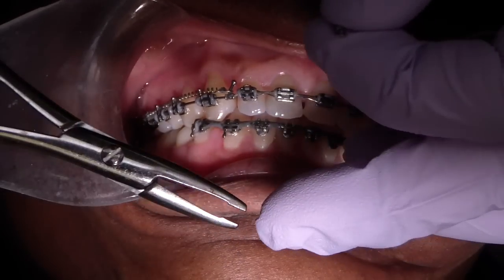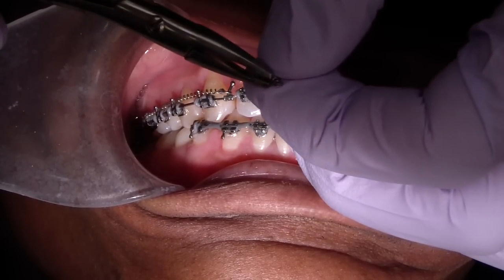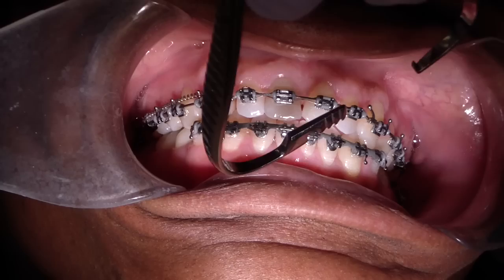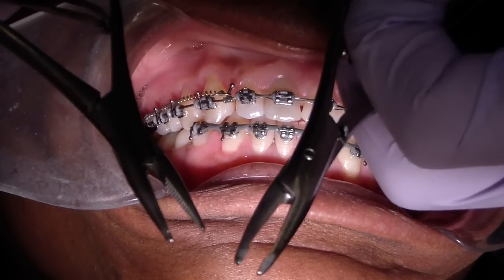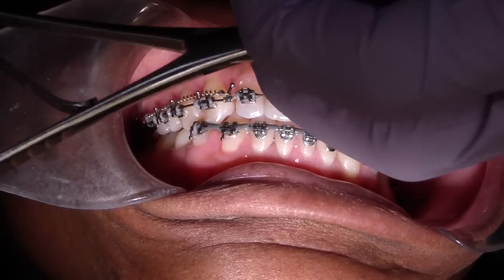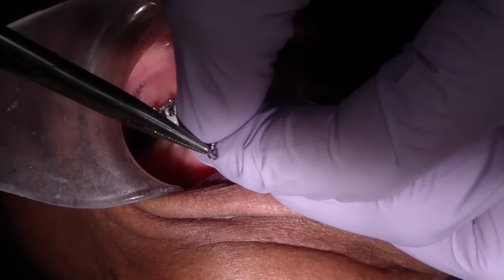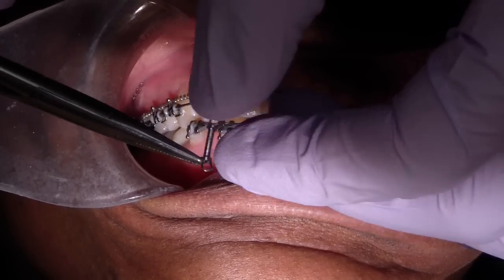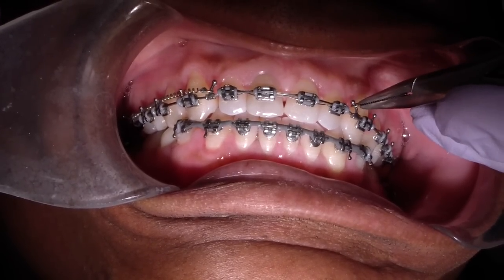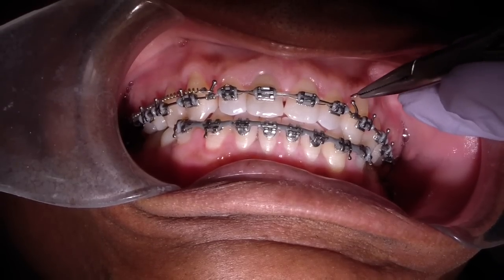So one of the key things is use the little skinny ones versus the huge ones. Okay, use the even smaller ones — I was expecting the big ones. Grab the loop, make sure you try it, because if you grab too much and there's no lumen, it won't fit.